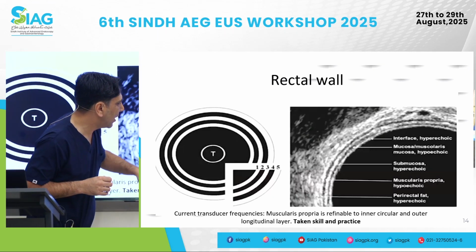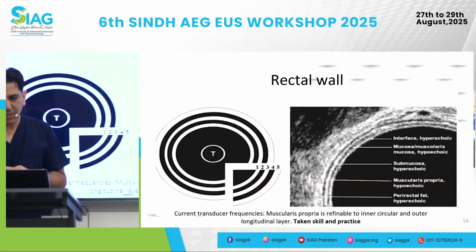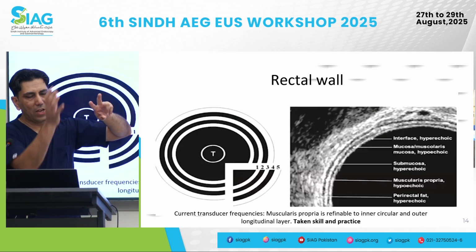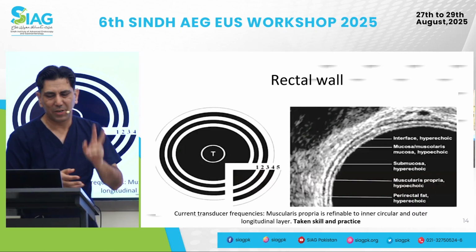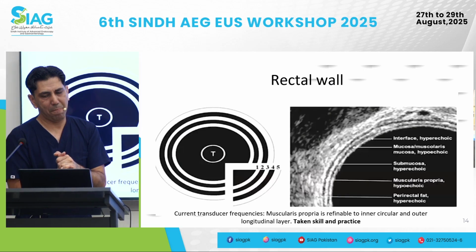Outside one, as we know, is the muscularis propria. It may not be projecting very nicely. And then the muscularis mucosae. Those are the two layers. We just want to look at everything around it, because sometimes you may end up confusing the interface of the probe with the mucosa. But identifying those two layers essentially helps in most situations.